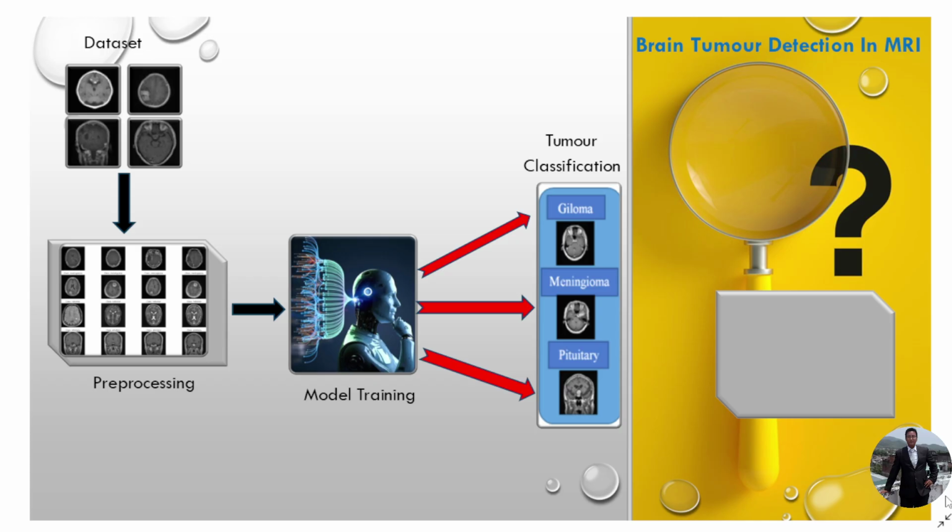So, in this session, we are going to create a new model for the detection of brain tumors. We will be using artificial intelligence, especially the convolutional neural network. And here the model is generally designed in three phases. The first phase is the processing phase, in which the different categories of brain tumor images are acquired, and then these images are pre-processed.